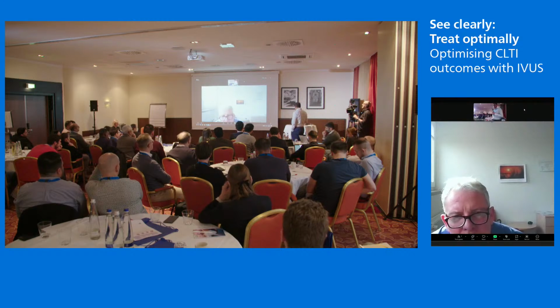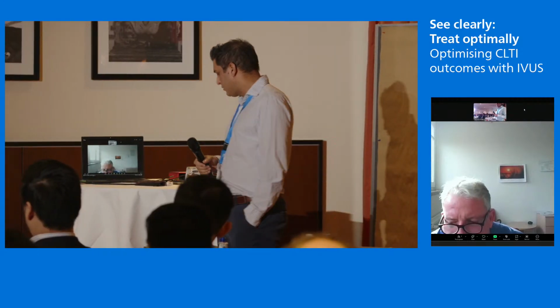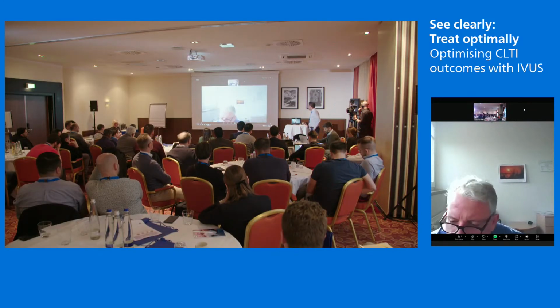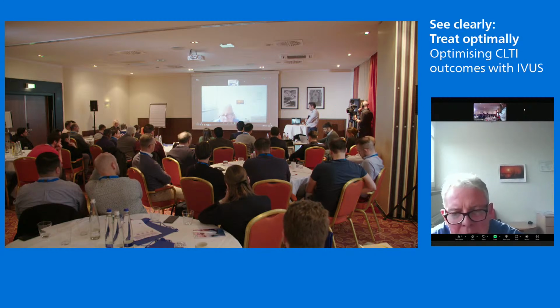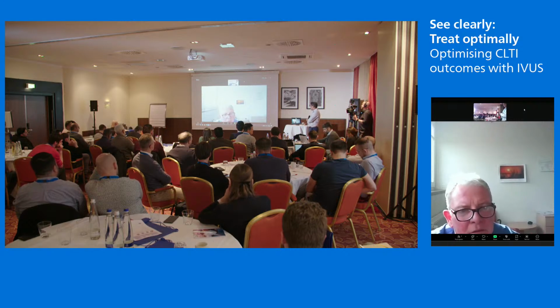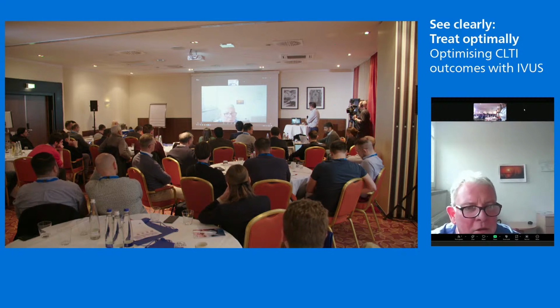Matthias, do you ever use a filter during these cases, or is the embolization risk so low that you don't need to? Yeah, definitely. So with laser, I don't. I've seen maybe 1 or 2 embolizations, but that was more a technical problem, which I had. But with the Phoenix, where you have really highly calcified eccentric plaque material, and maybe 5 or 6 of those in the SFA, then I definitely use a filter. And most definitely if I have a 1 vessel runoff.